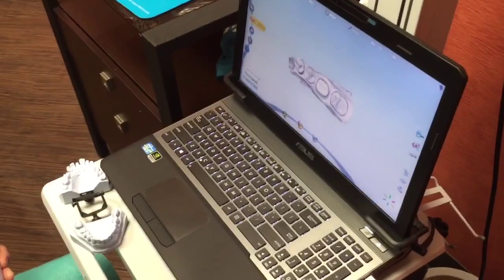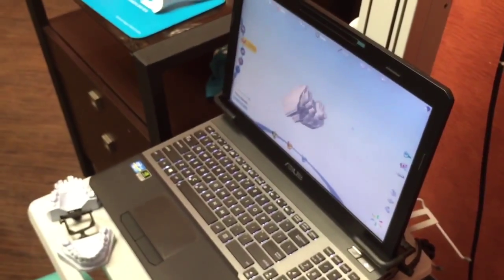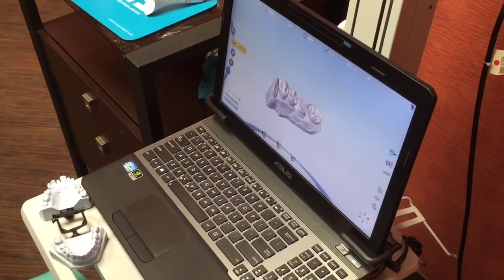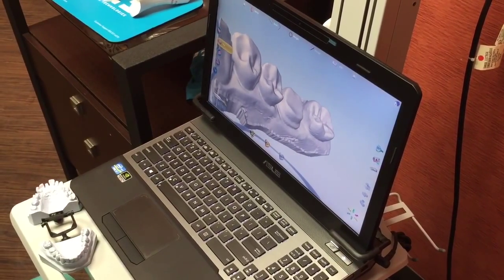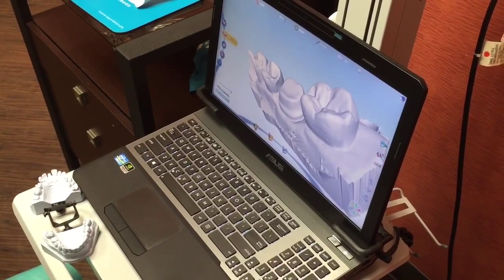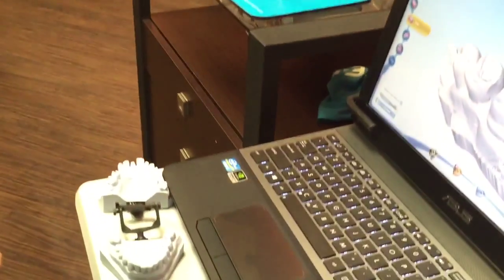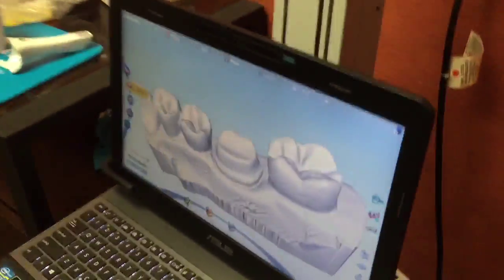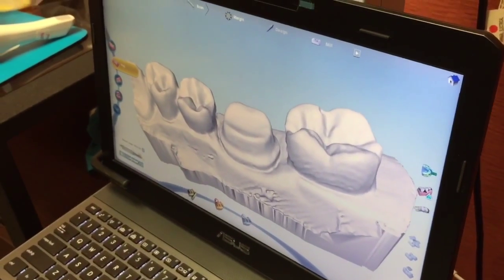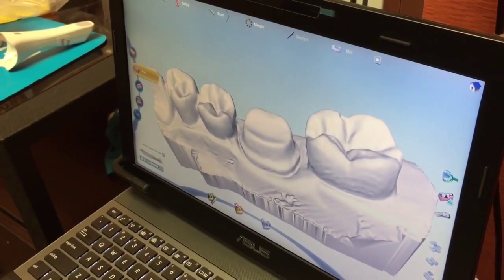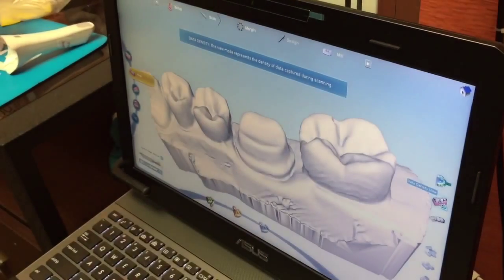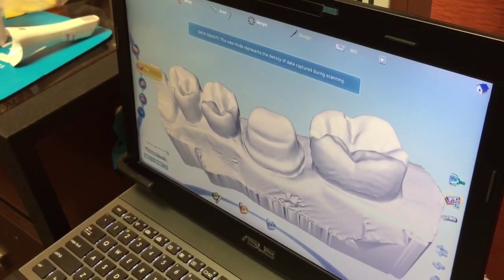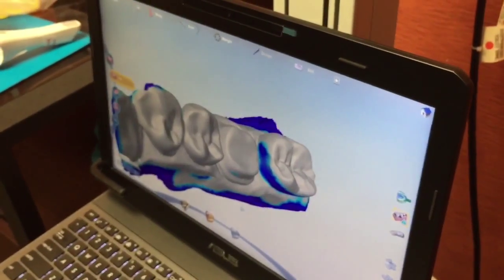Then you can left click here, right click here, press it down and hold it. You can see different 3D images. Now right here, you see how there's data missing? You can zoom it in like that with the mouse. See how there's, it doesn't look like a tooth? That shows that when I scanned it, I didn't capture enough data. You see that right there? See how there's no tooth here? The problem with this is, when you're designing Crown, if you don't have the proper amount of the right application of the data, then the software doesn't know where your contact's going to be.